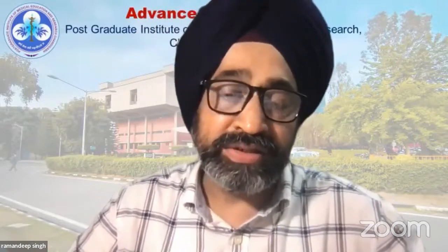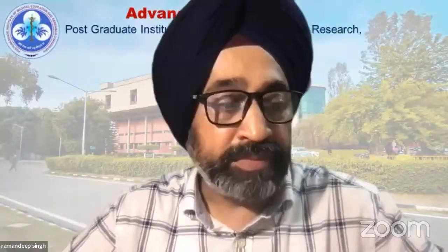Yeah, so I think what Dr. Jatinder has already said, I totally believe in that. If I have to really go for indices, my indices remain the size of the hole, how symptomatic the patient is, and the autofluorescence works a lot. I don't want anything else in multimodal imaging. Just an OCT and autofluorescence are good enough to tell the patient prognosis, and they work most of the time in these patients. So you are saying OCT and autofluorescence will win the game in macular hole surgery, both preoperatively and postoperatively? Absolutely. Yeah.